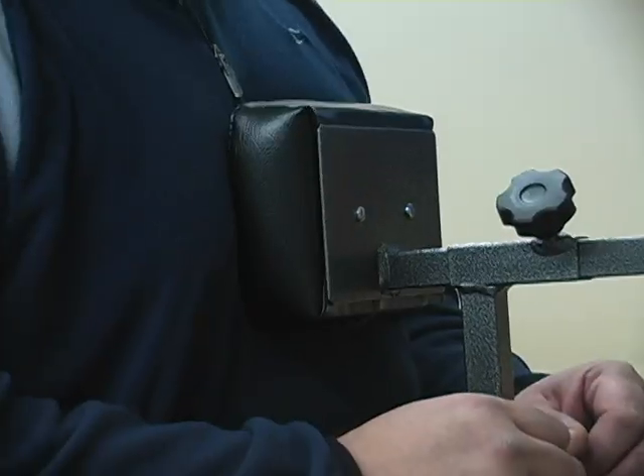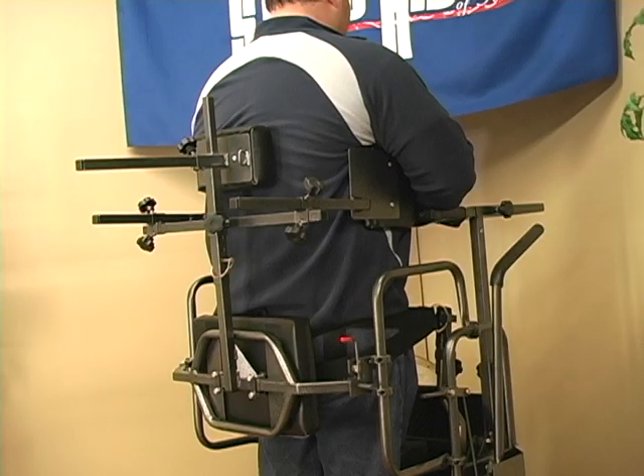Support pads such as the one-piece curvature knee pad, back, lateral, chest, and hip pad are available and can be added as needed.